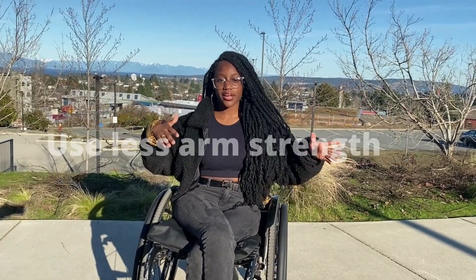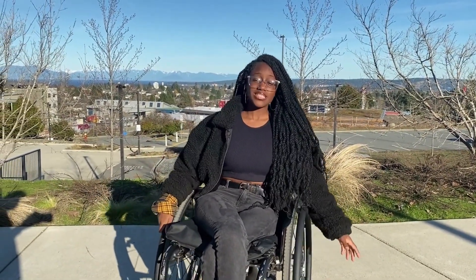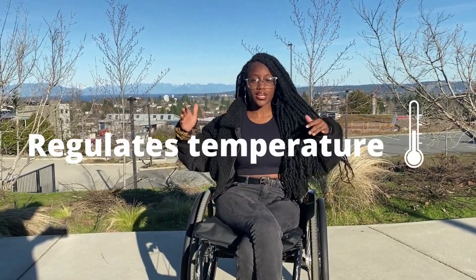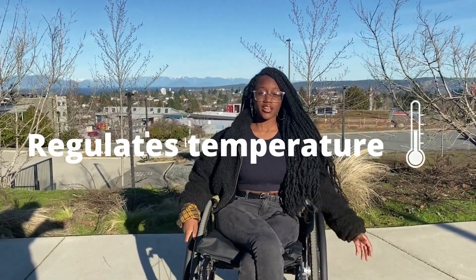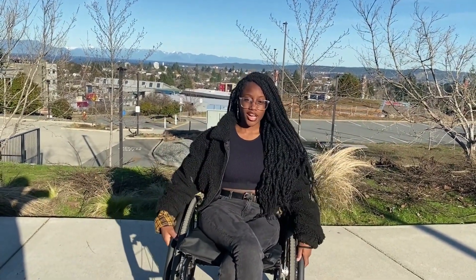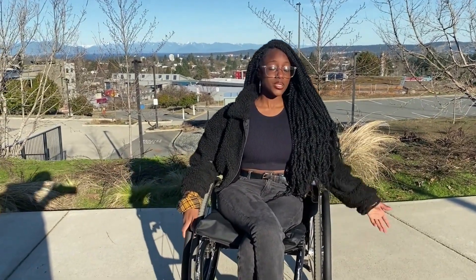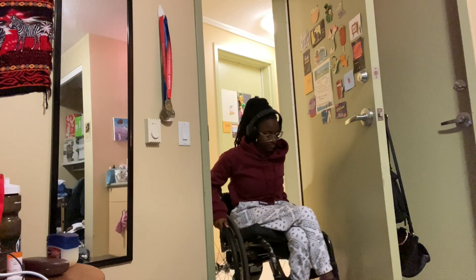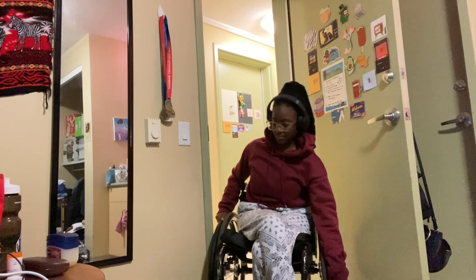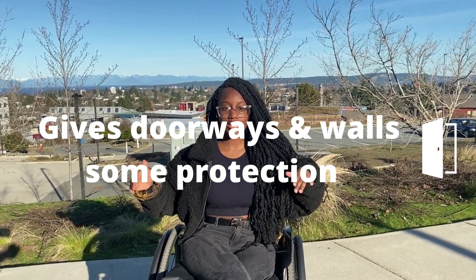So if you can minimize where you're putting your strength, that's an added plus. Secondly, I love their ability to regulate temperature — so if it's really cold or really hot, you don't really feel that directly on your hands because of the padding that the push rim covers give. And also, since I'm fairly clumsy and I run into things pretty easily, I feel like it helps with the walls, like maintaining and not getting dents and stuff. So that's another pretty cool thing about them.